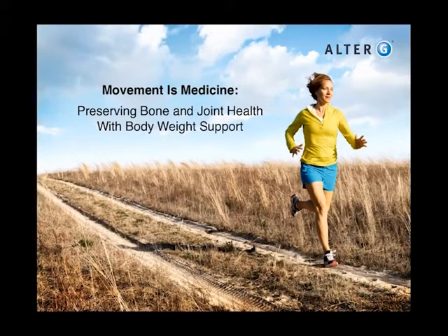Well, the anti-gravity treadmill really measures body weight support. And with that, you can let your physician know that, for example, my patient, Joe Smith, can only tolerate 60% body weight. So we're going to need to continue physical therapy, because if they're not at closer to 80 to 90% body weight, then they're not going to be comfortable in an overground situation. So that's one thing that the AlterG can measure.